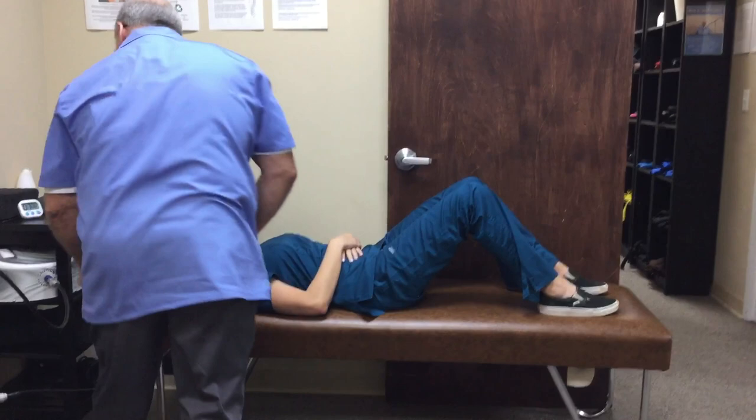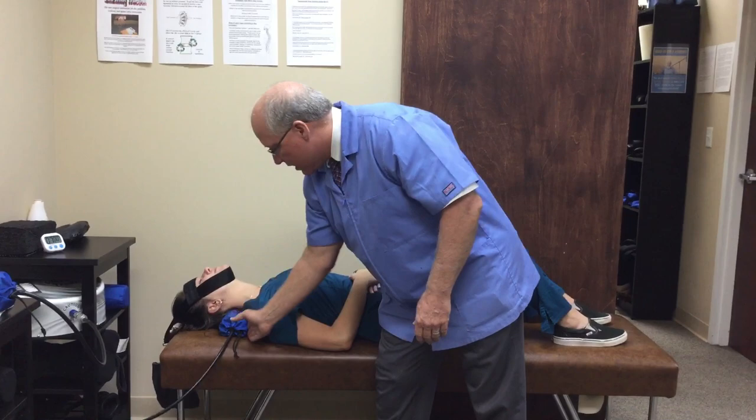This is vibrating at a frequency to be able to change the disc. Think about the discs in your neck — if they're not being used properly, it's like a dried up sponge in the garage. But if you dunk that sponge in a bucket of water and wring it out, then it comes back to life again.